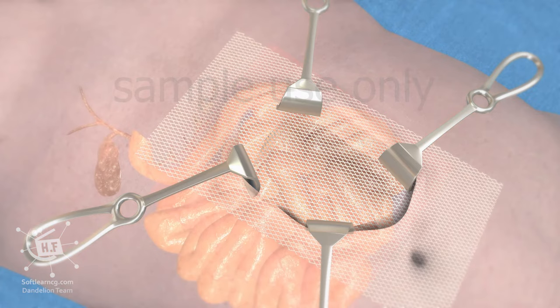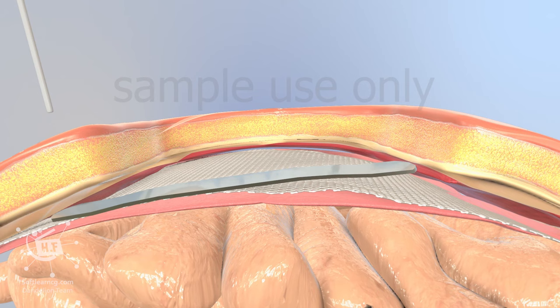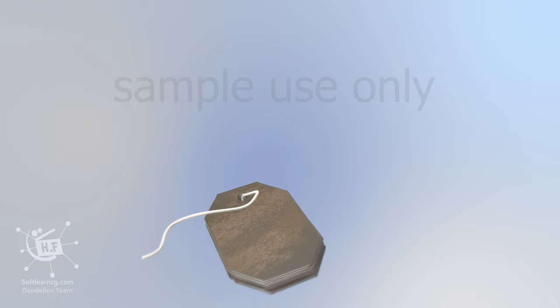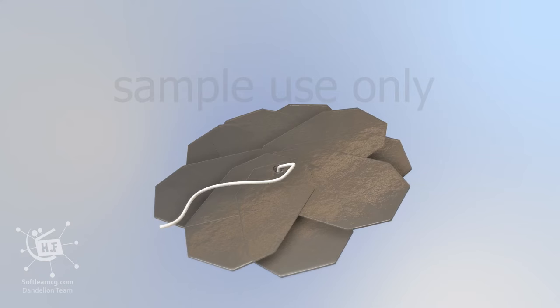This mesh now needs to be secured. This is traditionally done with a suture passer that requires a spatula operated by a second person to protect the intra-abdominal organs, including the intestines. Not only does finding the right placement for the spatula add additional time to the operation, but if the spatula is misplaced, an injury could result in the form of an adhesion, resulting in a bowel obstruction and possible chronic pain, or a perforation, which would abort the procedure.